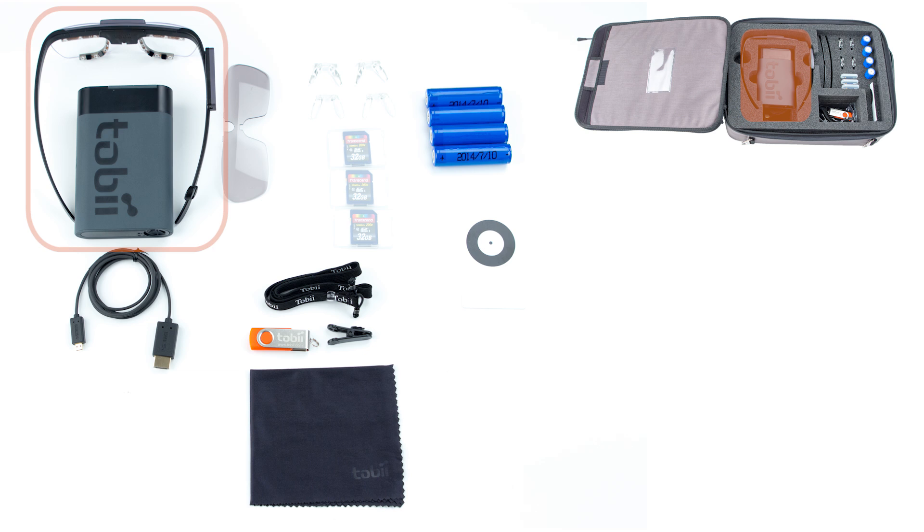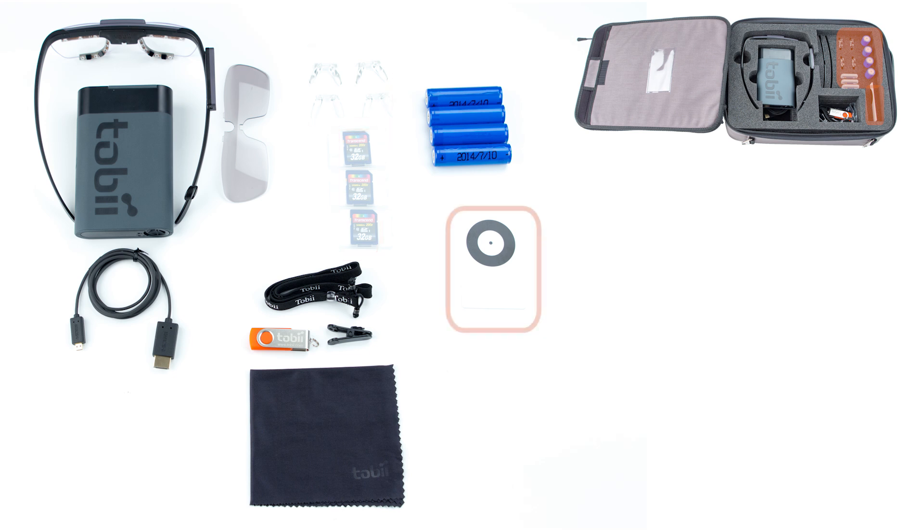We also have the recording unit and underneath that is an HDMI cable. On the opposite side of the case we have four rechargeable type 18650 batteries, four different size nose pads, three SD memory cards, a plastic calibration card, and a small section with a USB stick, head strap, cleaning cloth and a cable cord clip-in. On the underside of the lid is a small section which contains a quick start guide. Inside the guide you'll find everything you need to get started with the Glasses 2.